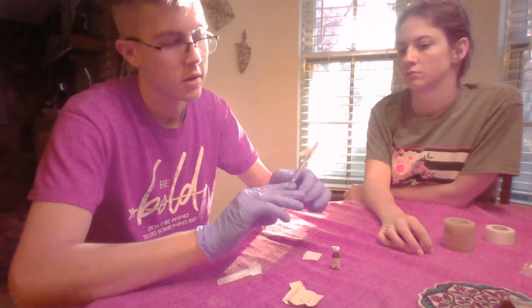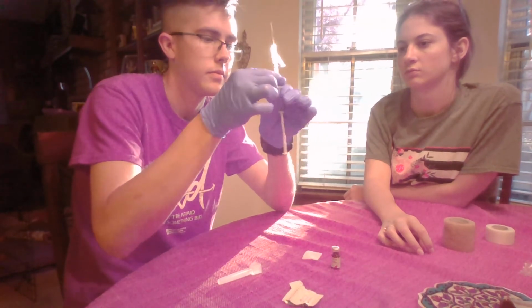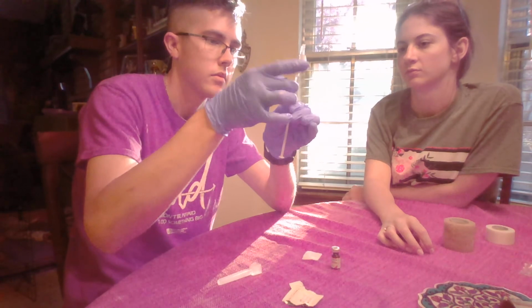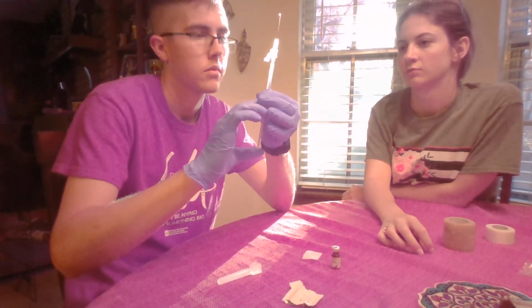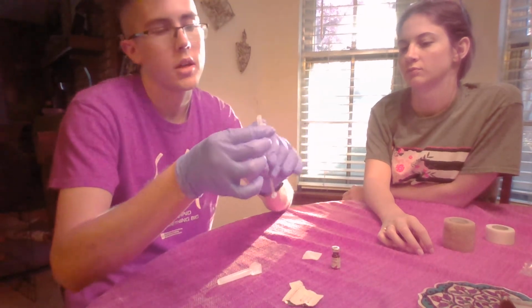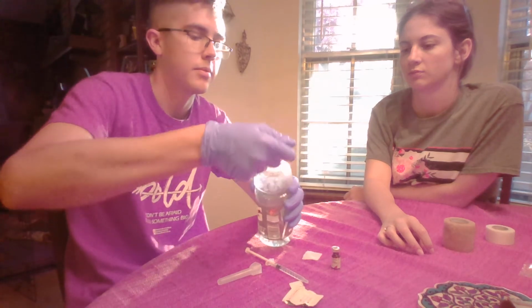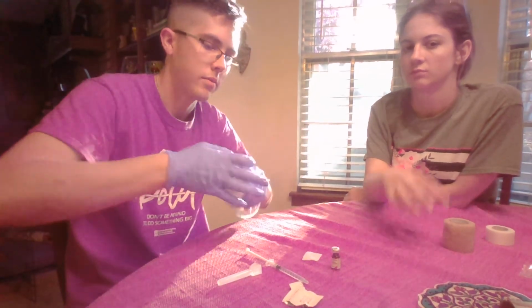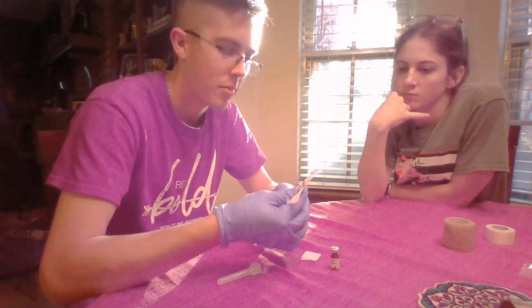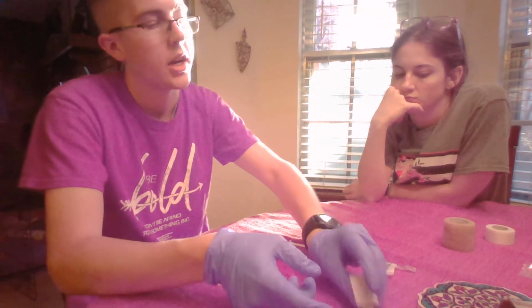Remove all the air bubbles out of it. There we go. Okay, take this, put it in my dandy little sharps container. And then I will take my atomizer, put it on my needle.